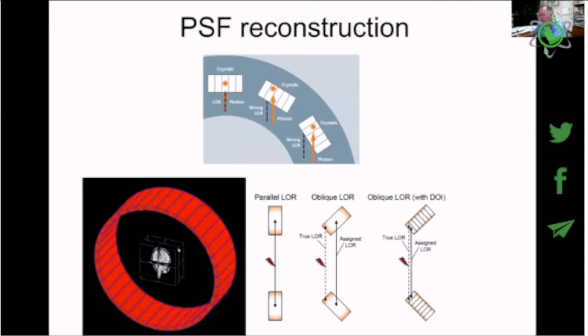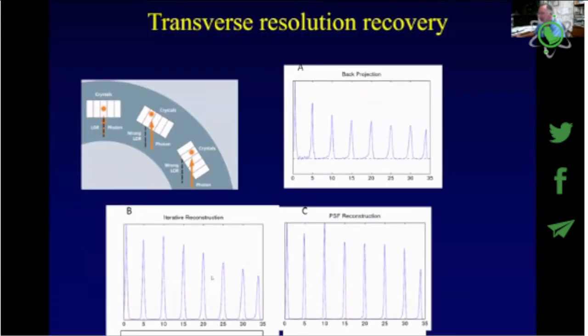We know that in a PET scanner, the resolution is not uniform across the field of view. So if you are in the center of the scanner versus when you move to the edge of the scanner, radially in this case, the resolution decreases. And that's primarily because the annihilation photons are going to hit the detector, rather than hitting it head on, at an angle. And as such, rather than being detected in this detector, they will be detected in a detector that's adjacent to it. And that becomes even worse as you move further to the edge of the scanner in this case.